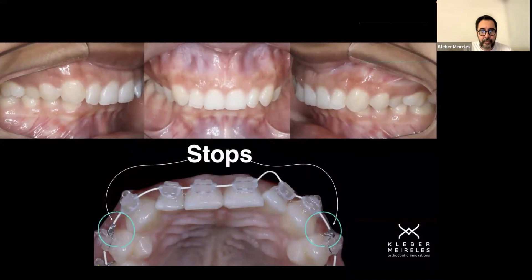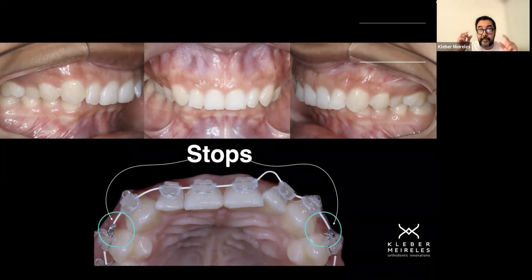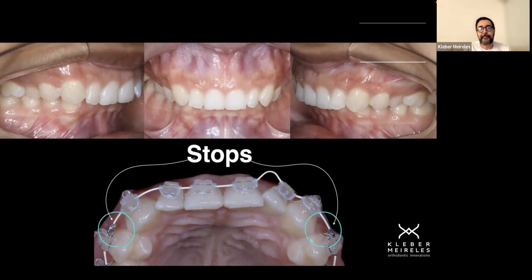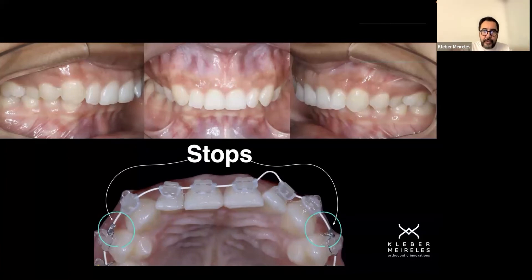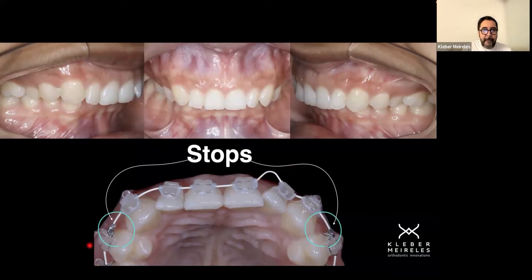Since the beginning, we tried to decompensate the problem by advancing anterior teeth and posterior teeth. Since day one, I bonded the upper brackets and from the first day I was trying to do the protrusion using what we call these long stops. We want to protrude the anterior teeth using these stops. And as you can see here, we have this deflection of the arch wire, meaning we have this protrusive component of the arch being compressed with the stop.